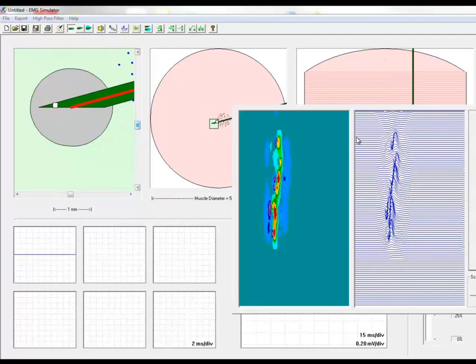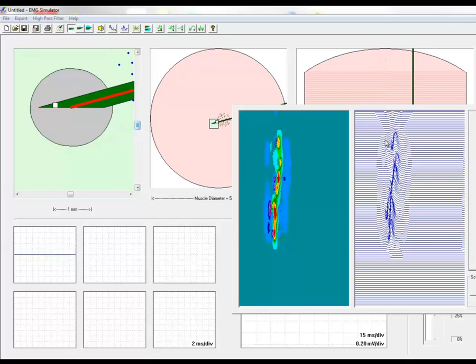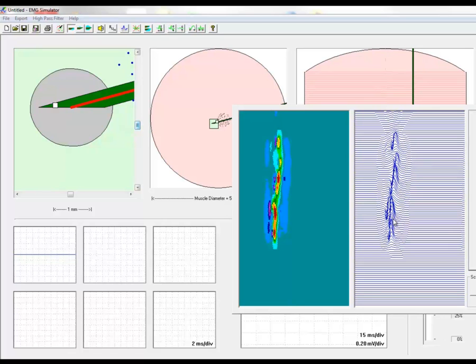In the right panel we see the individual motor unit potentials and how their shape varies from one side to the other in the same motor unit. There are areas with other delays and other fiber action potentials and here it disappears. This is about 10 millimeters.